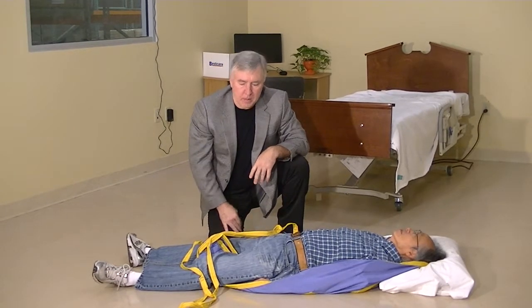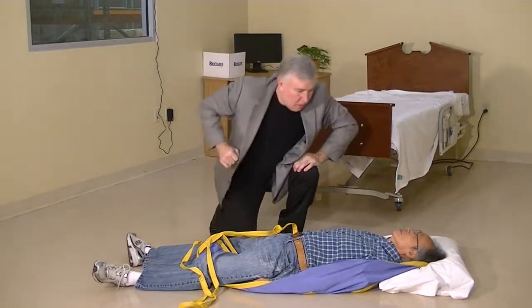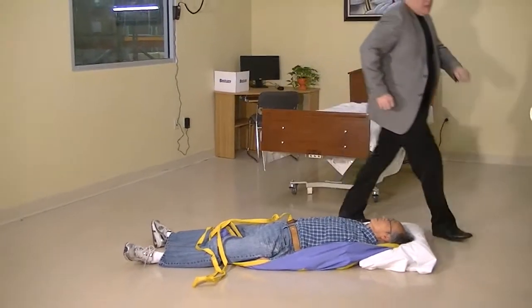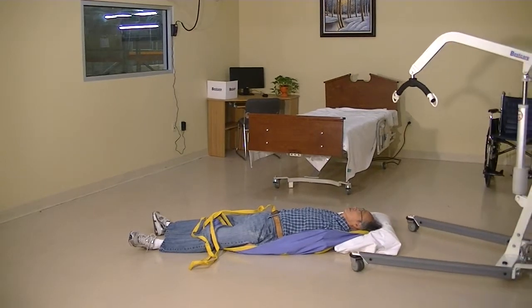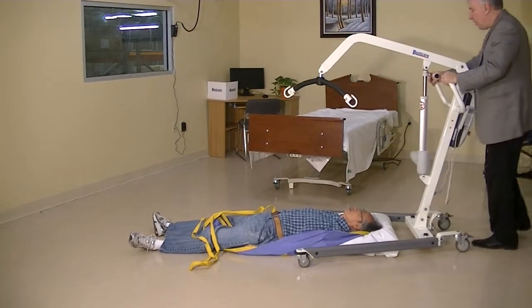Now we have the sling applied to the patient while they're on the floor. Let's connect the sling to the lift. I'm going to use the two-point spreader bar, like before, and bring it up to the patient in exactly this fashion.